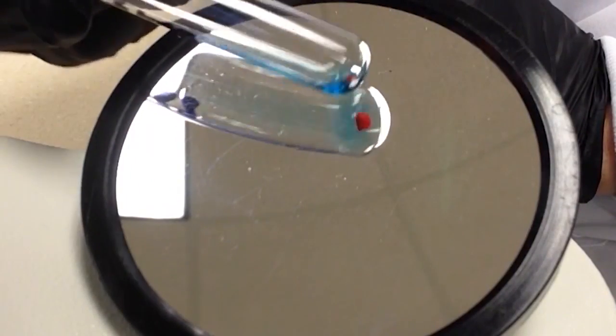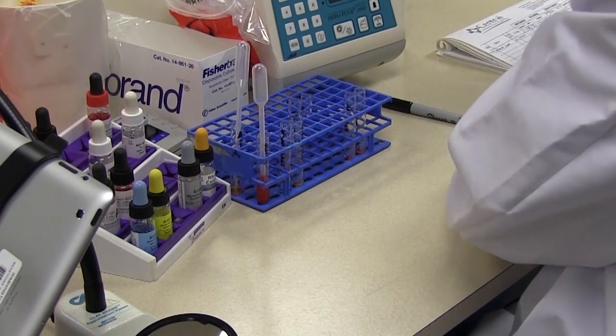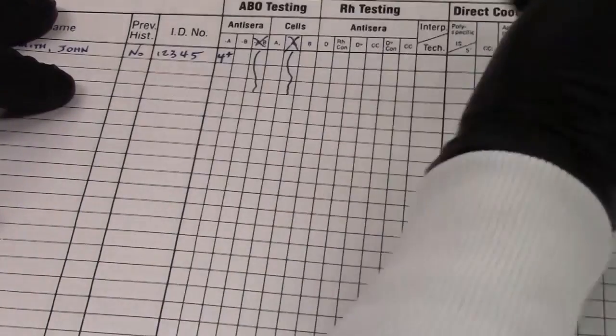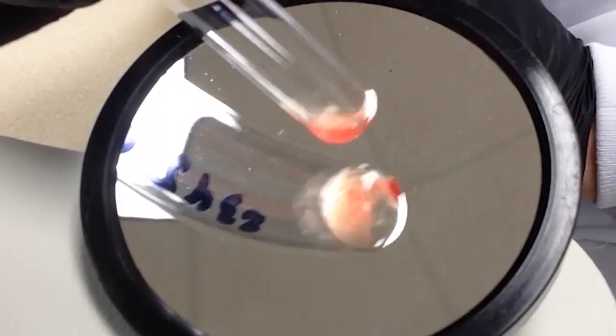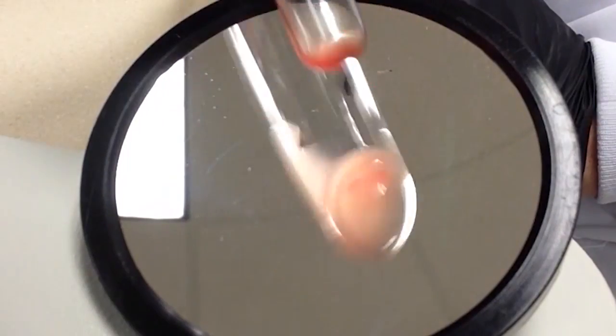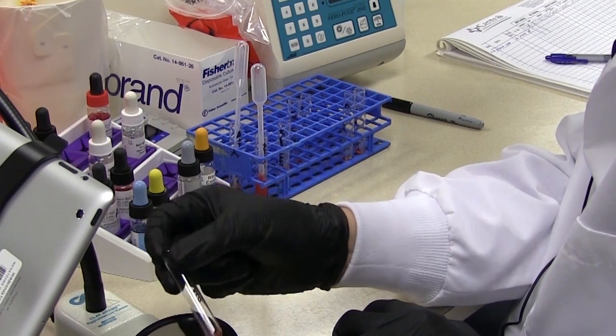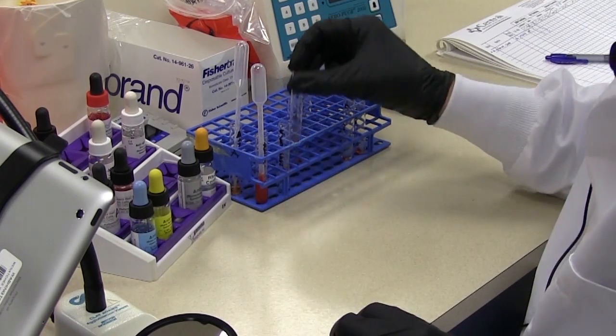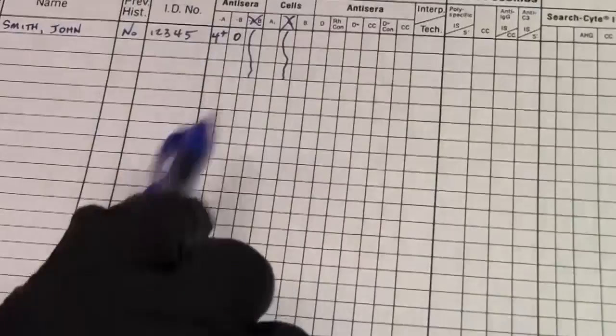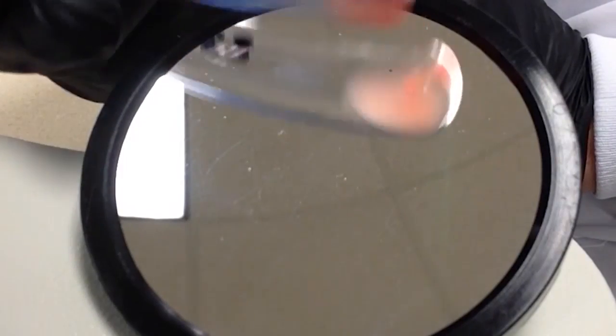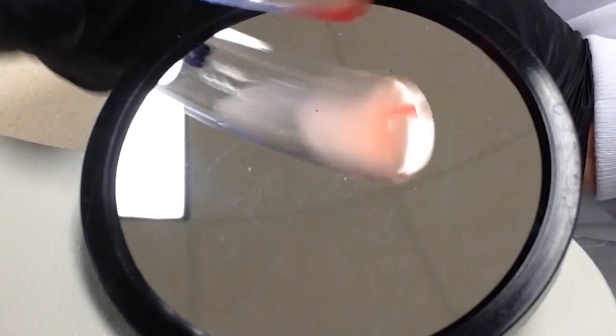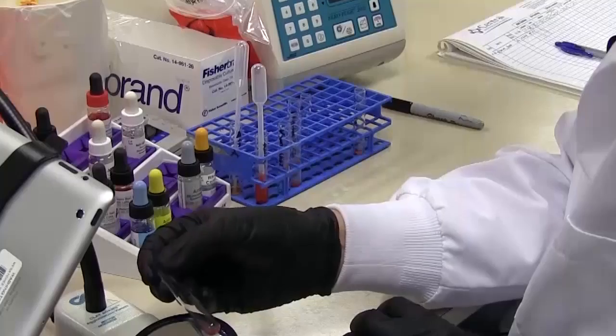So this is the anti-A. Okay so it looks like we have a four plus button there. So on our results log here we'll put four plus. Okay anti-B kind of tricky here getting it in view for you guys to look at in the mirror. Okay so that's coming off smoothly and I don't see any kind of aggregation of cells so that is a negative which we will record as zero.